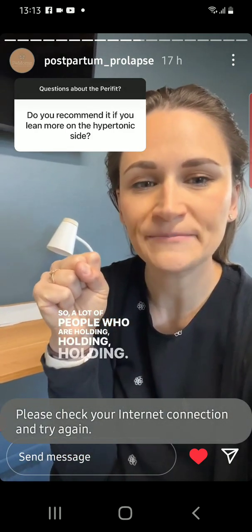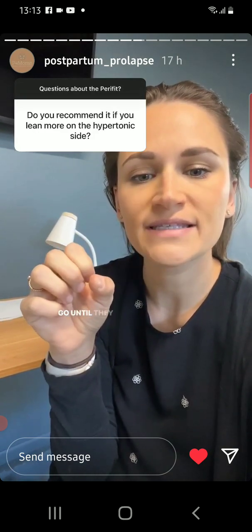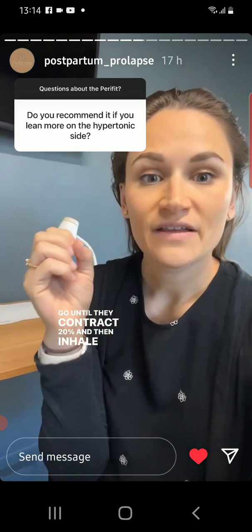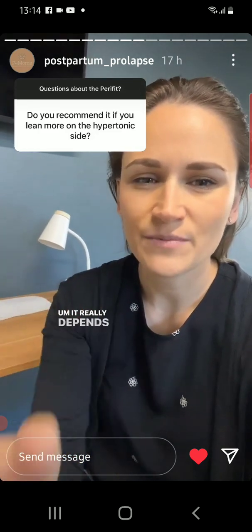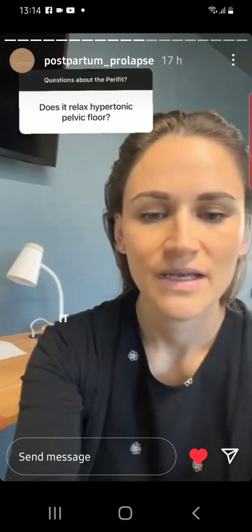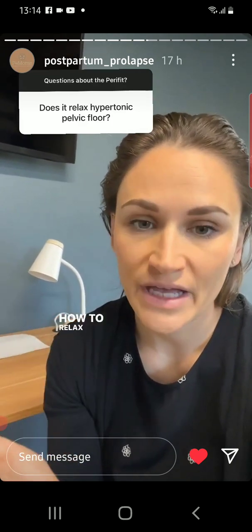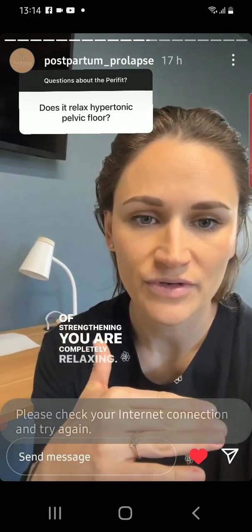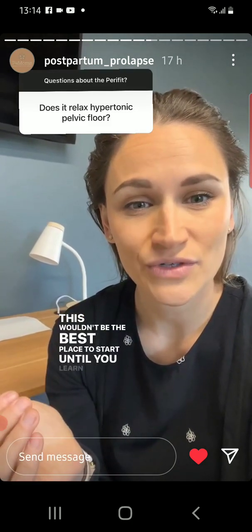A lot of people who are holding tension don't really get the concept or the sensation of letting go until they contract 20% and then inhale and feel more of that muscle excursion — if that makes sense. So this could be helpful in that sense. It really depends on your situation though. It does not directly relax your pelvic floor muscles, so you have to have a good sense and awareness of how to relax your pelvic floor so that in between the cycles of strengthening you are completely relaxing. So if you don't have a good concept of how to do that, maybe this wouldn't be the best place to start until you learn how to do that.